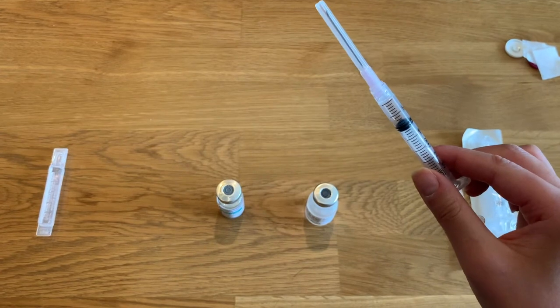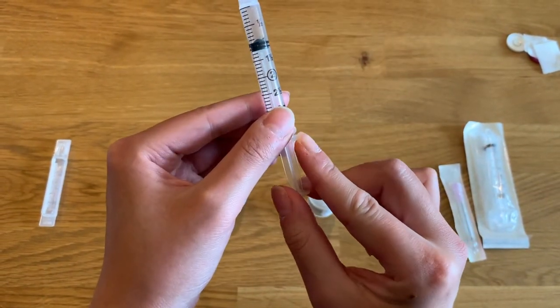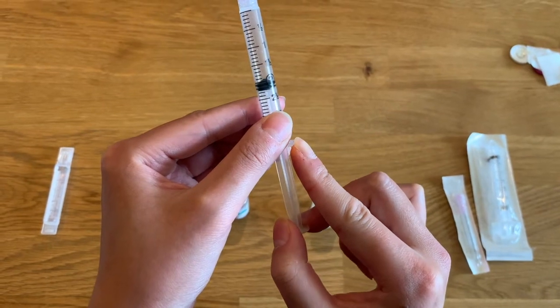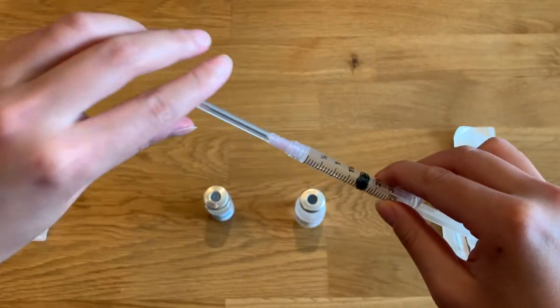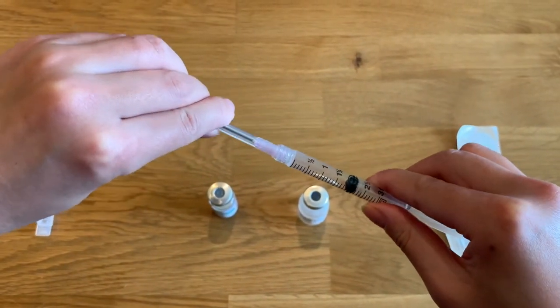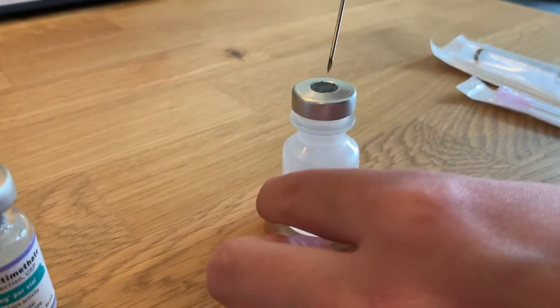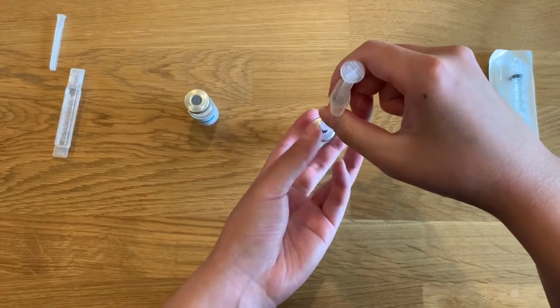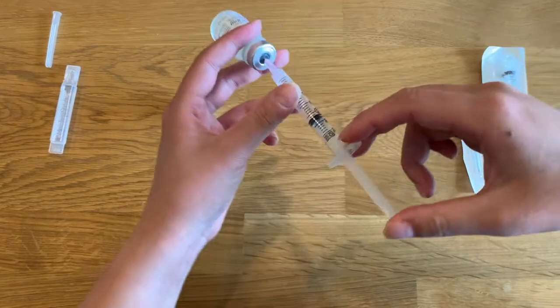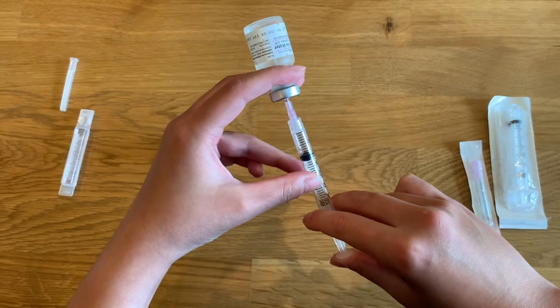Pull the plunger back to 2 milliliters so that you can introduce air into the sterile water vial to help equalize the pressure inside of the vial. Once you have the plunger pulled back to 2 milliliters, swiftly pull off the protective cover from the needle. Then push the needle through the top of the rubber stopper on the sterile water vial. Once the needle is through the stopper and into the vial, pick up the vial and the syringe, invert them, and push the air into the vial.